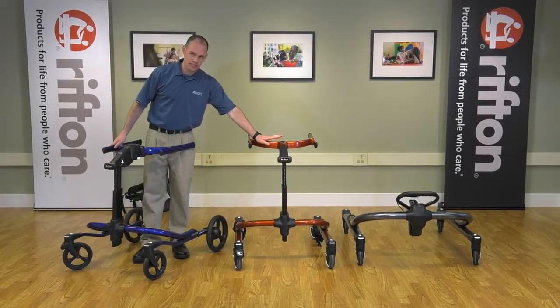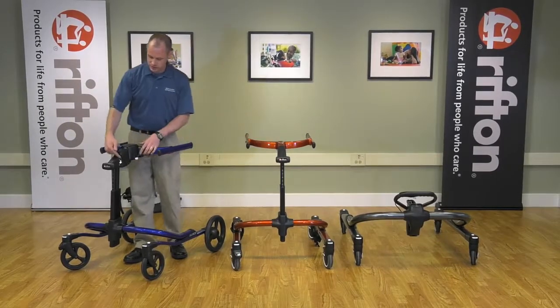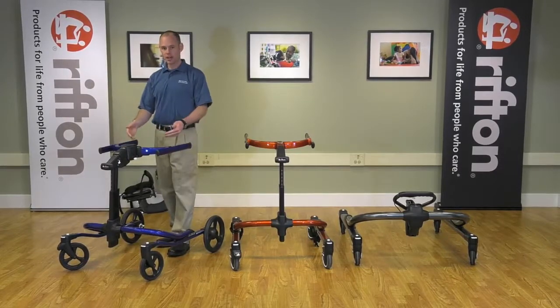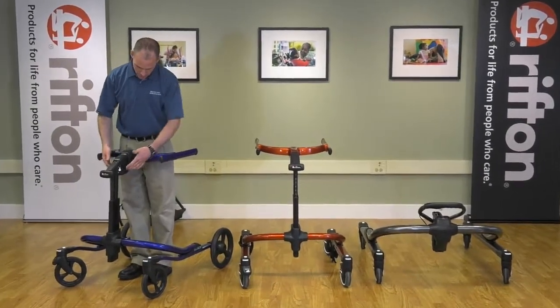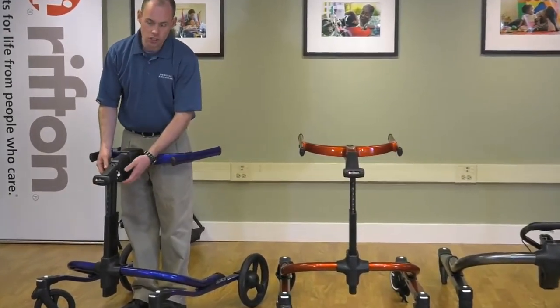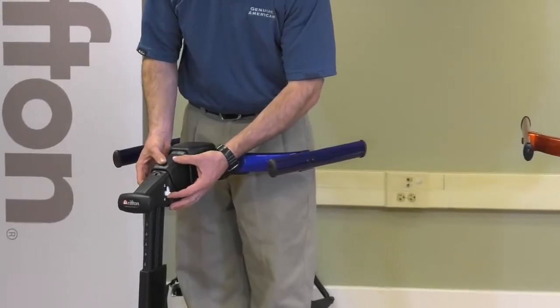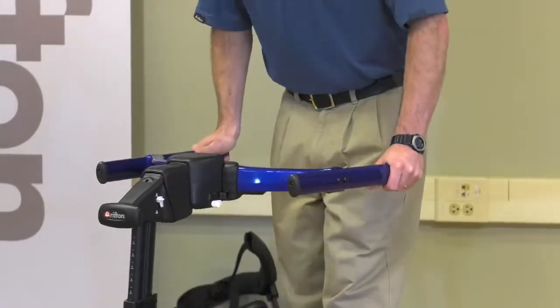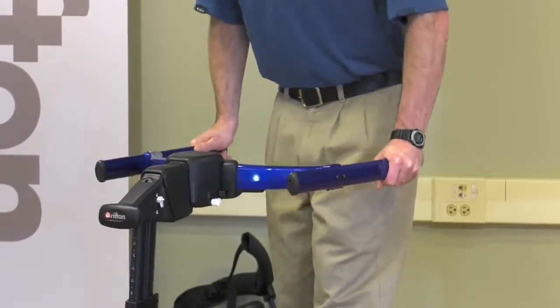Here you see this is a standard upper. This is a dynamic upper, and you'll notice it has adjustments which allow you to lock out the dynamic feature or unlock it. Right now we're in locked position. To unlock the vertical movement, you just push this lever up to the unlocked position, and you get 3 to 4 inches of play up and down.